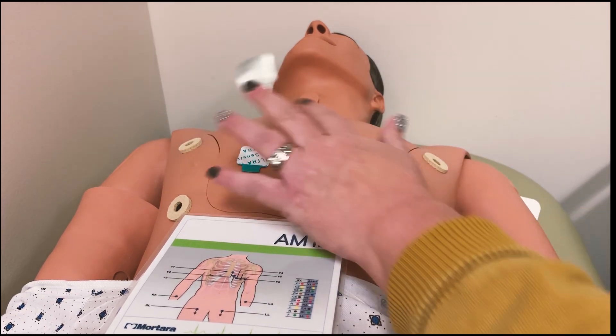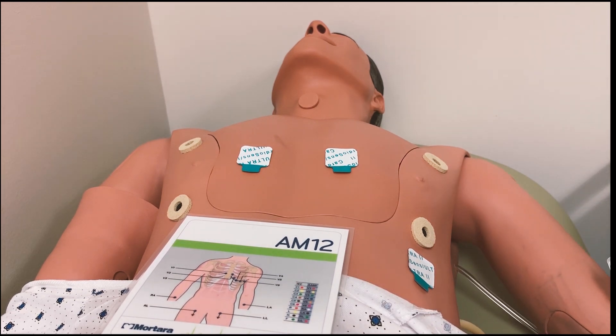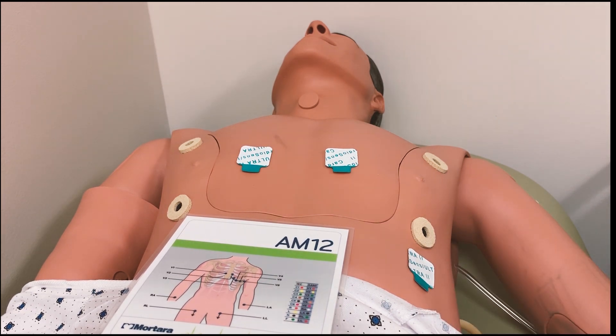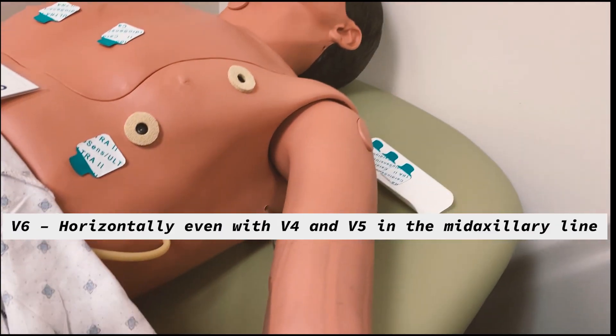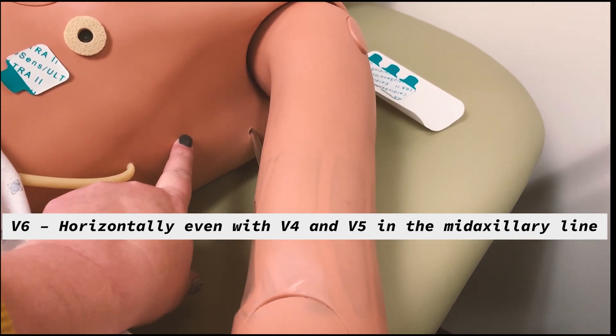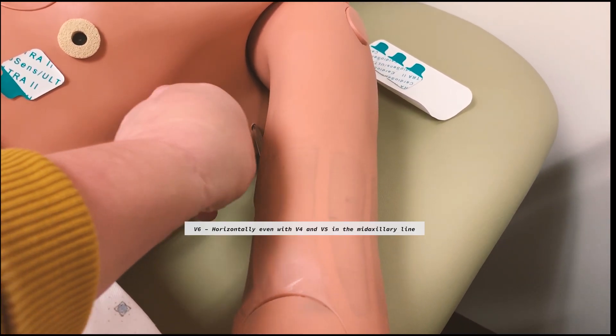So we've got one, two, four — I like to skip five — and then I go over to six. For V6, it is mid-axillary line and mid-nipple line. So mid-axillary is mid-armpit, and mid-nipple horizontally. We put V6 about in there.